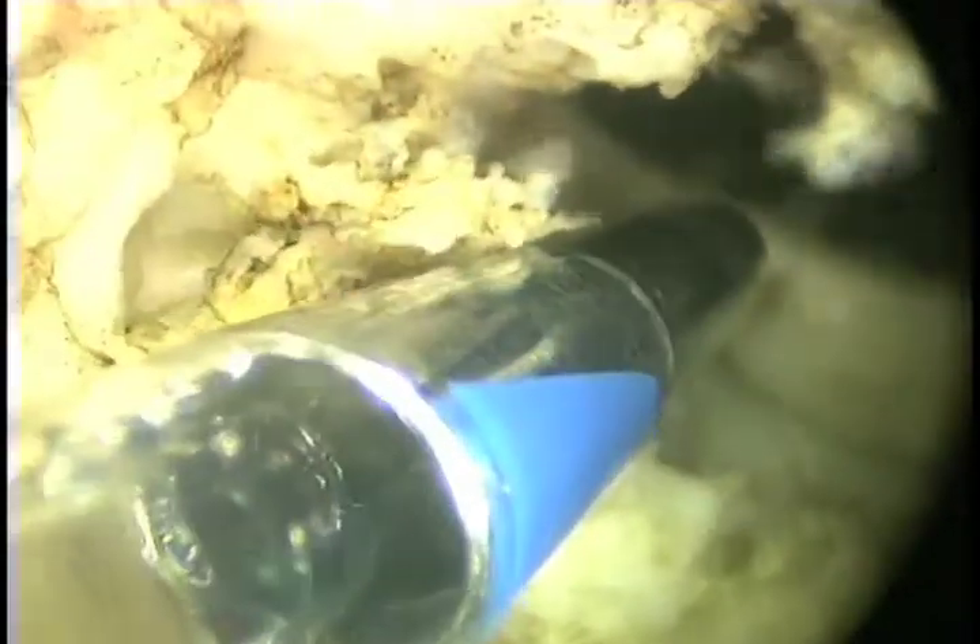Note the adequacy of tissue removal and the size of the bubbles emitted during vaporization. The distance between the laser fiber and the plasma bubble — which is the most intense area of orange-crimson — is optimized to be less than 2 mm. As the surgeon backs up close to the sphincter, it is important to be judicious both on the energy level and the level of return of the fiber.